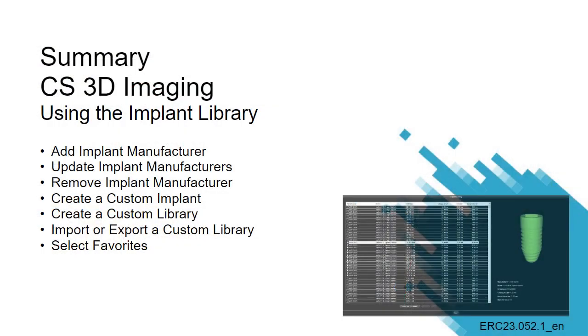This concludes CS3D imaging using the Implant Library recorded class.